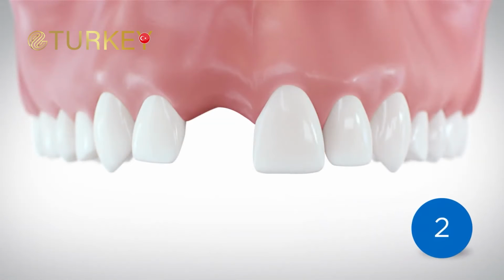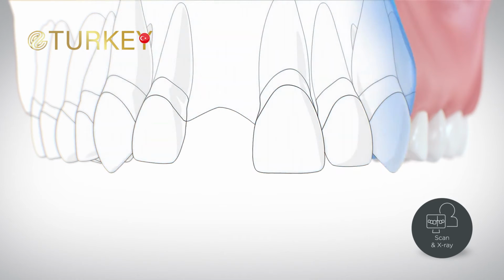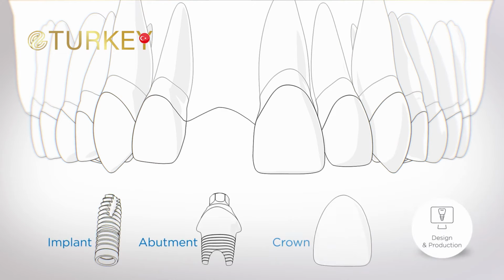Once you opted for the implant solution, Step 2 includes an X-ray and scan of your teeth, gums, and jawbone. This is how a digital model is created, which perfectly matches your individual anatomy and forms the base for the design of your implant-supported tooth.